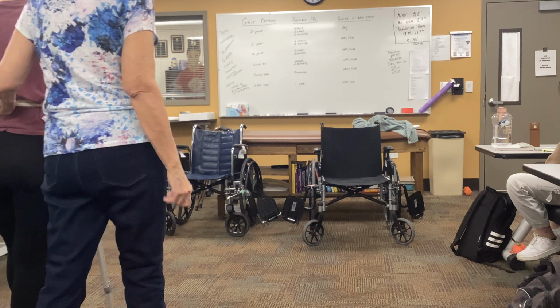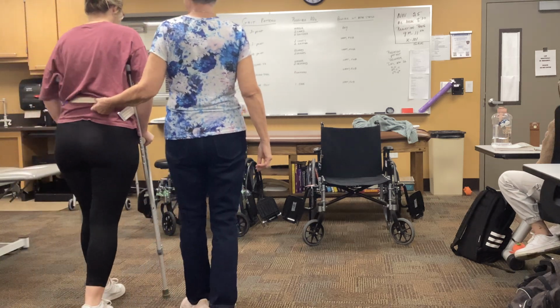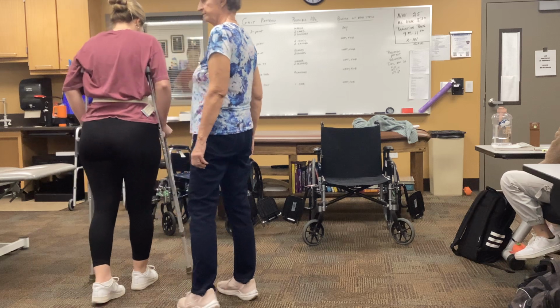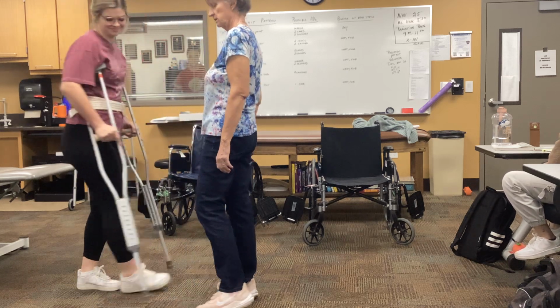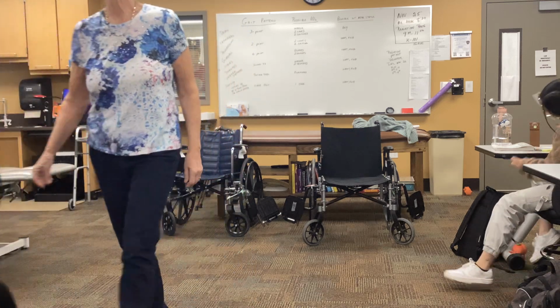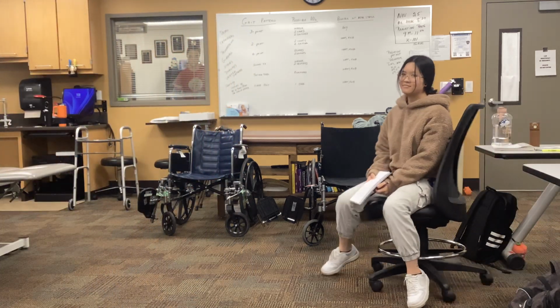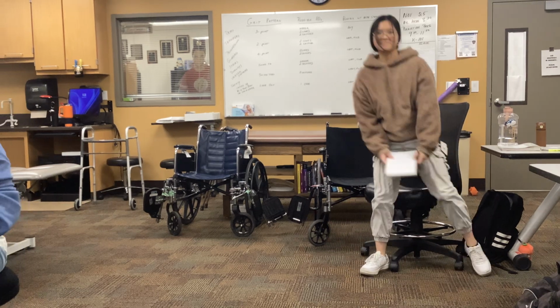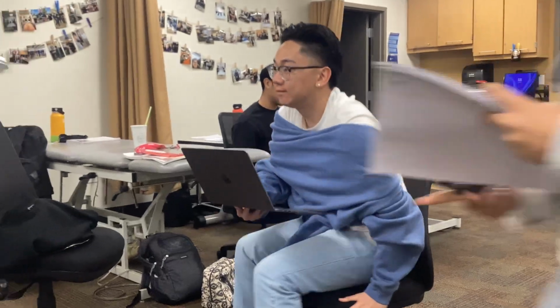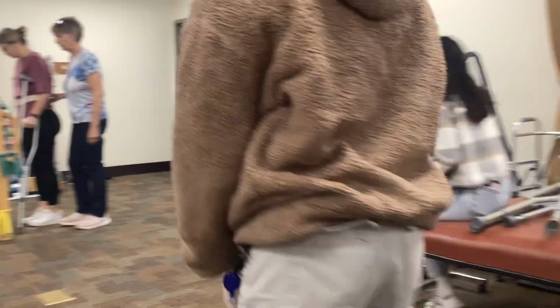I can feel her thinking about it. Okay. Questions there? All right, let's go take a look at the stairs with the crutches. 2-point gait.